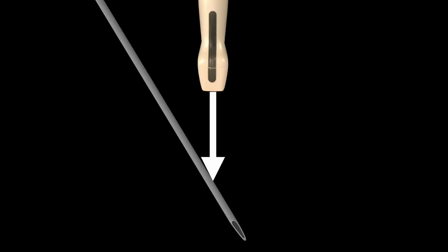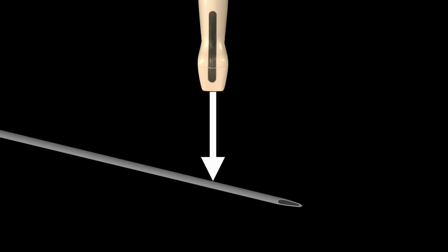So when we think about it, if we go very steep with the needle, an ultrasound beam comes in and hits it, but the problem is the majority of it, just due to ultrasound physics, is deflected away from the probe, and you get a very weak signal back, so you may not appreciate that needle and where the tip is. Now on the converse, you can go flat, at a lower degree, and it's great because you get a lot of image back, which is great for using ultrasound, but the problem is sometimes you run out of catheter in order to hit that vein.